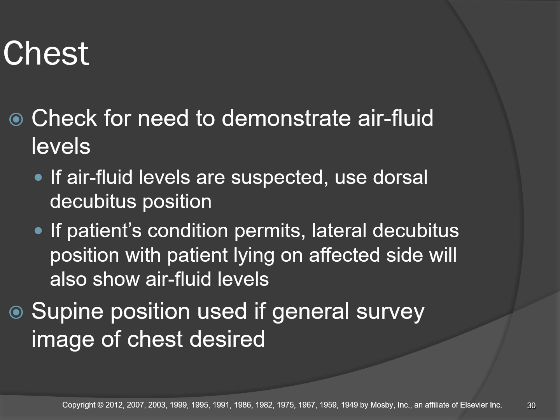If they're looking for acute rib fracture, hematoma, pneumothorax, associated atelectasis, they're just trying to assess if the lungs are inflated, if they have pulmonary markings, any kind of survey, gross pathology. Yeah, AP supine, no tube angle.